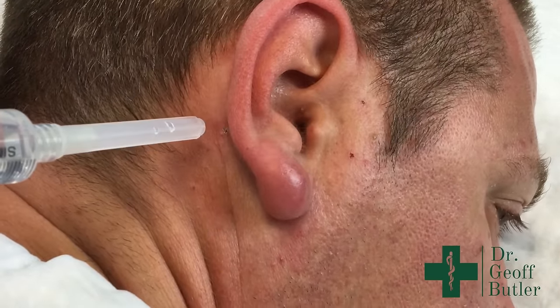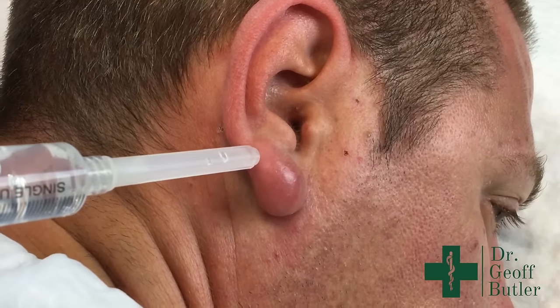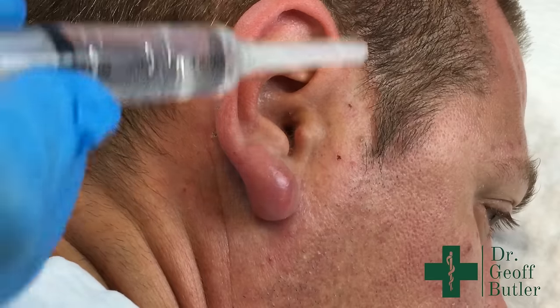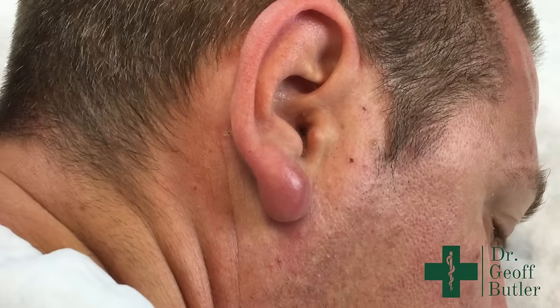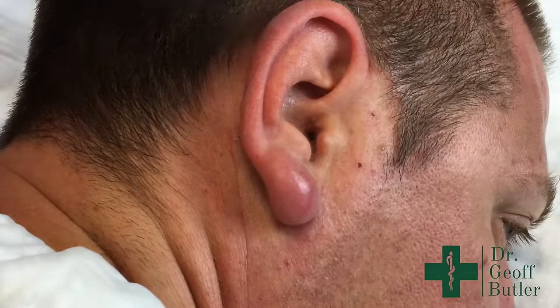With respect to the nerve supply of the ear, I've already done a block around the ear. When tissue is infected, it affects the anesthesia. By doing a block around the ear, hopefully he'll be a lot more comfortable. I'll add some extra at the base — it may not be absolutely necessary, but it maximizes comfort.